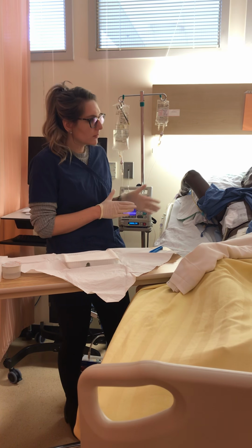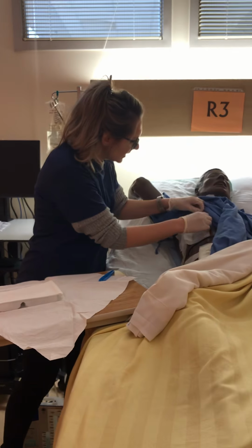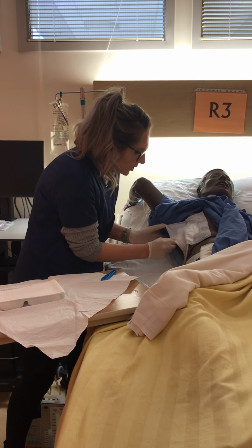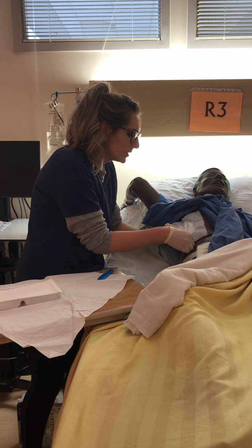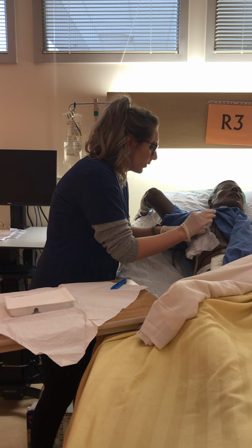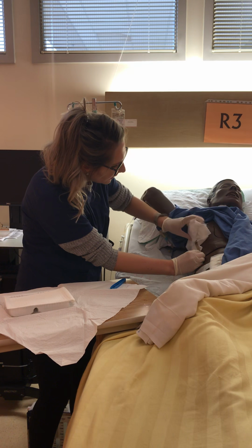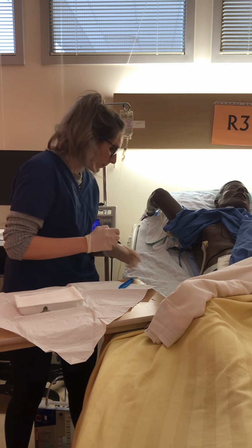Okay, so now I'm going to start removing this. This tape is quite sticky. On a real patient, it doesn't stick quite as much. And I want to be gentle because I don't want to dislodge the tube. So that's another thing that you check for in your safety check, to make sure that the tube is not dislodged. So I'm just going to go through here, being as gentle as possible, stabilizing the tube. There we go. So I'd be noting any drainage or coloring on this tube.